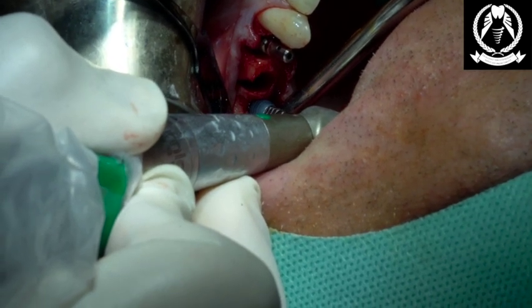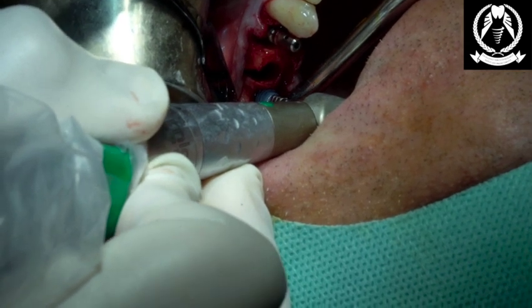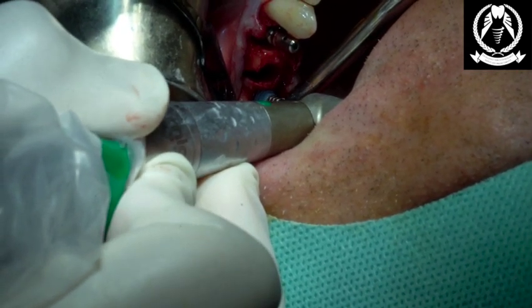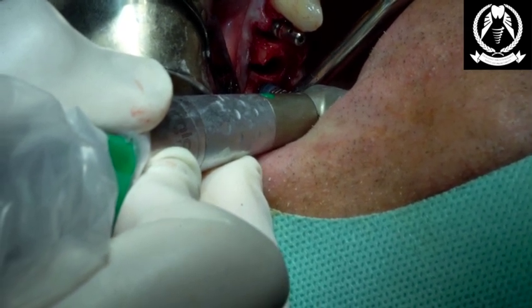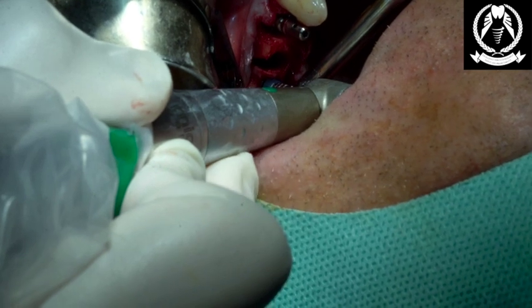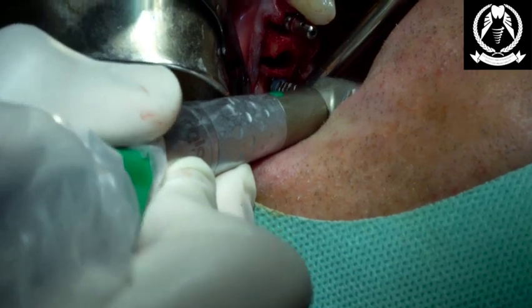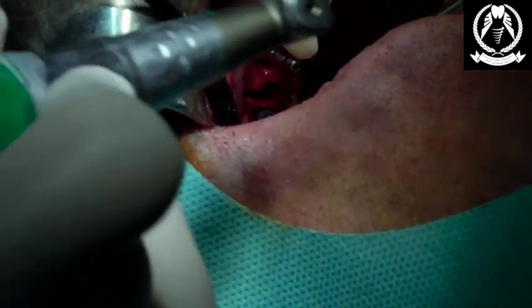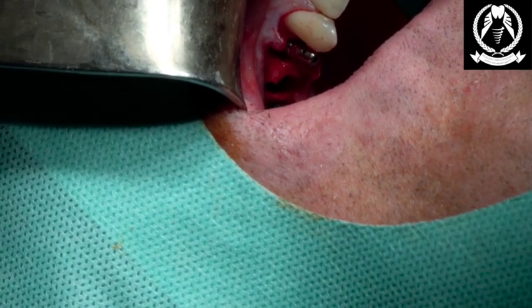37, 44, 48, 49, 51, 52, 61, 62. So you're getting these sort of torque figures off, and we're maxed out at 70. Okay, so when it maxes out at 70, you can hit 100. With this particular implant, it doesn't matter, and I'm going to show you how to now relax it to get that last few mil of where you want that implant to be.